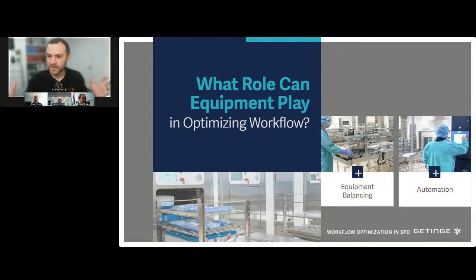But when you zoom out and look at the department data and what instruments arrive to the patient, I think the data will show that it's more efficient to have that one piece flow that keeps the equipment running and keeps things moving through the department. So that's a really great point. Steve, I want to touch on your experience with this as well, because I know that you've been in sterile processing for a long time. What role have you seen equipment play in optimizing workflows?